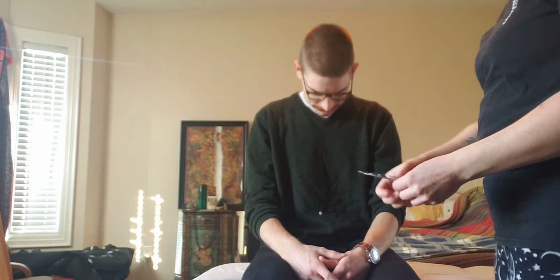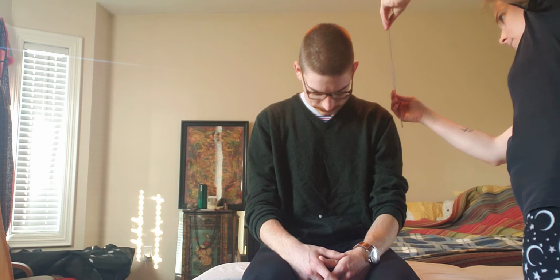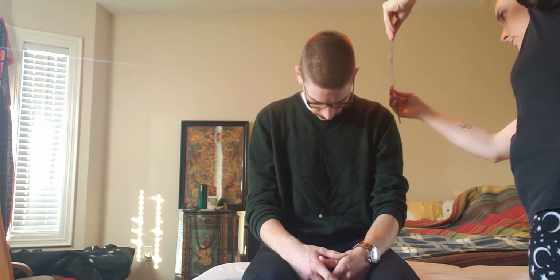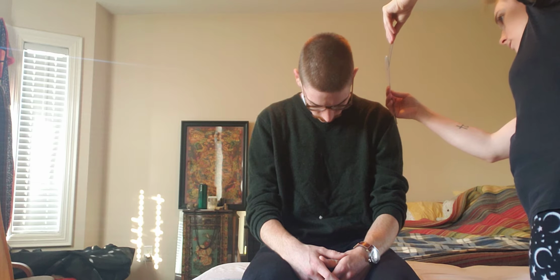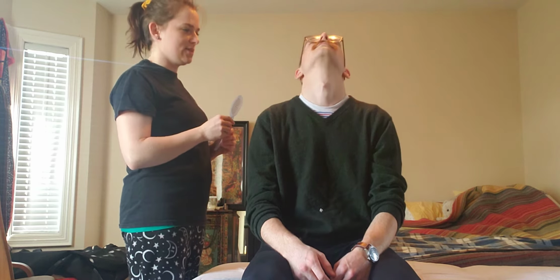So we'll start the assessment portion now. I'll start with active range of motion. So I'm just going to come over here and ask Cameron if he could drop his chin to his chest, and I'm going to measure it with the goniometer. And Cameron's range is within normal limits. It's 70 degrees. And I'm just going to now ask him to drop his head backwards and look up at the ceiling.